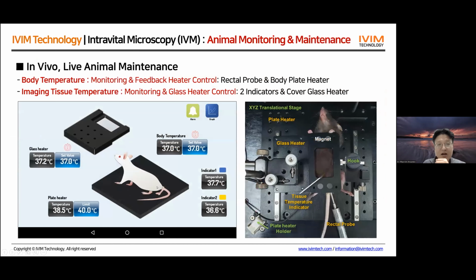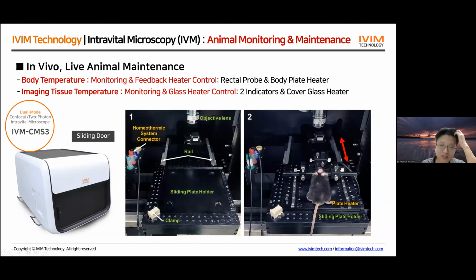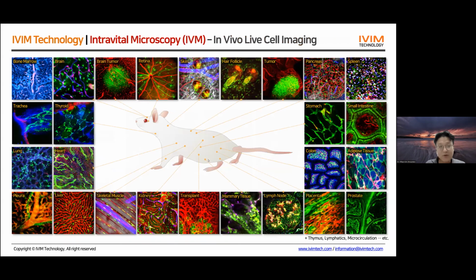Also inside this box, we have taken care of body temperature control by using this tablet PC. It is a tablet controller, and we also have a heating and temperature control system to maintain the temperature inside the box. By using this microscope, we have been able to image almost every organ in a live mouse model.